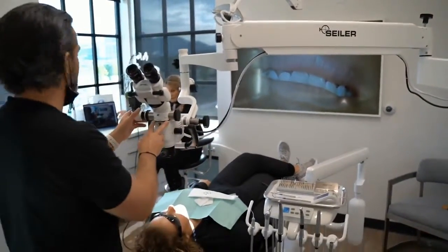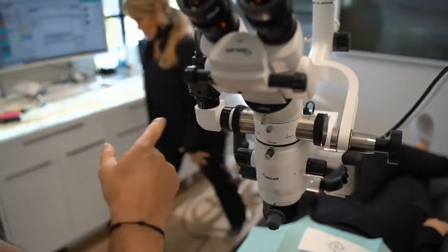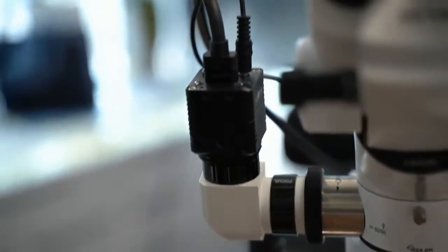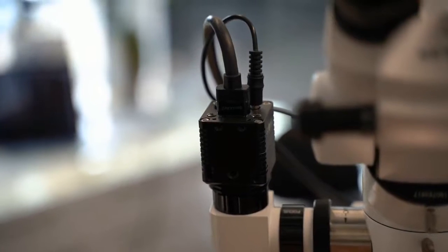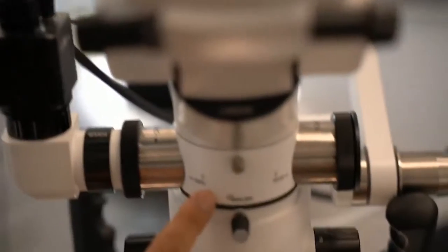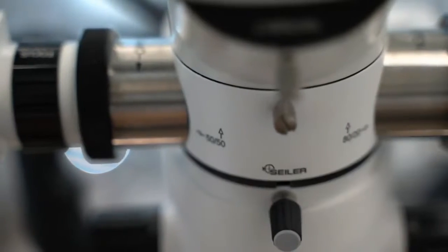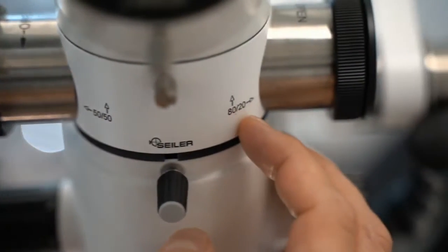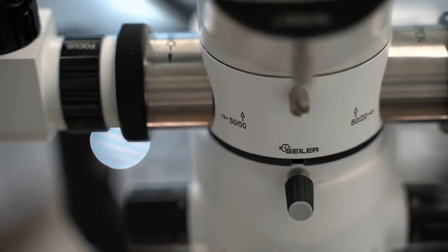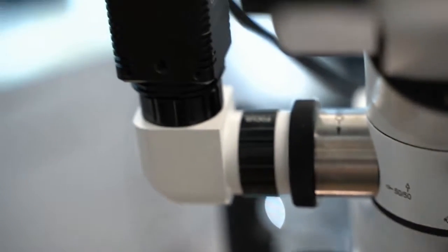Now, if you want to zoom in right here on this beam splitter, there's also a light gain. And there's different cameras. Like I said, there's GoPro, which is really easy to use. But there's also the ability to take out light. So I'm trying to get right where my finger is. This is a 50-50 right here. And over here is an 80-20. And it's just what it says. It splits the light. So you pick your camera and you pick the side that is set up for the type of camera that you buy.